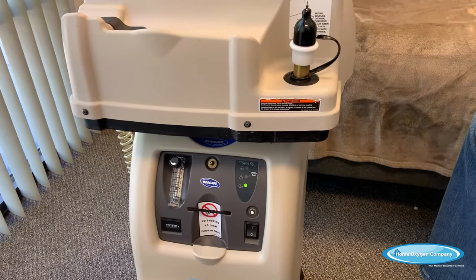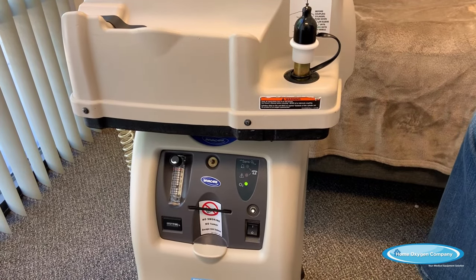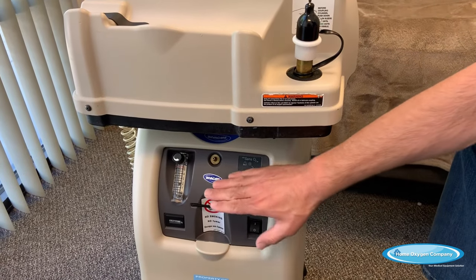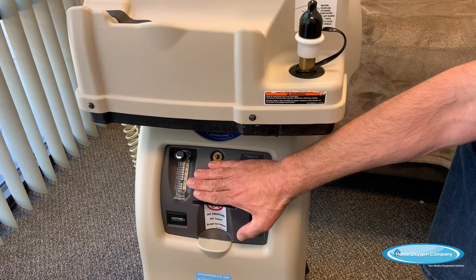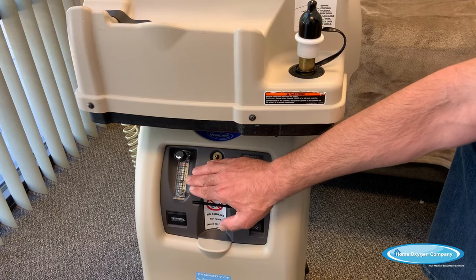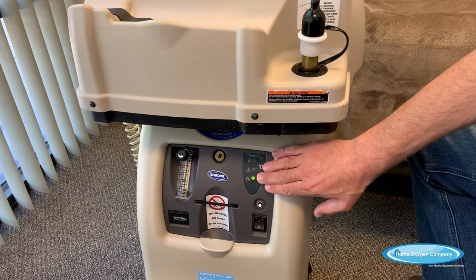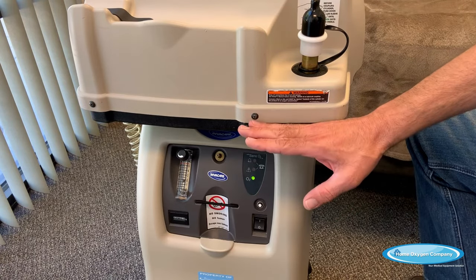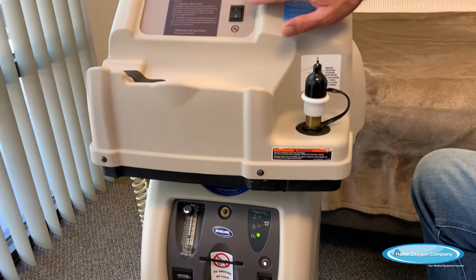The way the home fill compressor works is it takes the air from the concentrator, sends it up to the compressor, and into the home fill tank. To start, there are a couple of things you need to have set. First of all, on a five-liter machine, your oxygen concentration level needs to be at or below three liters per minute, and your green O2 light needs to be lit up, which means the machine is ready to fill.